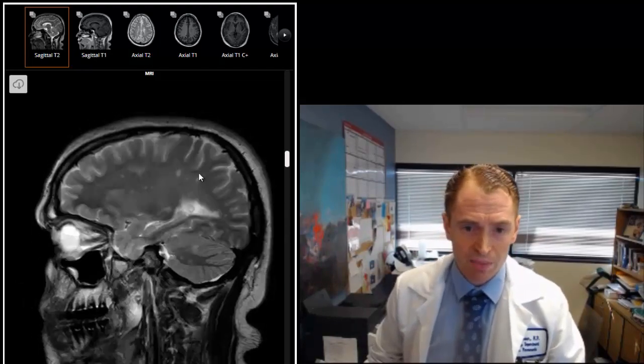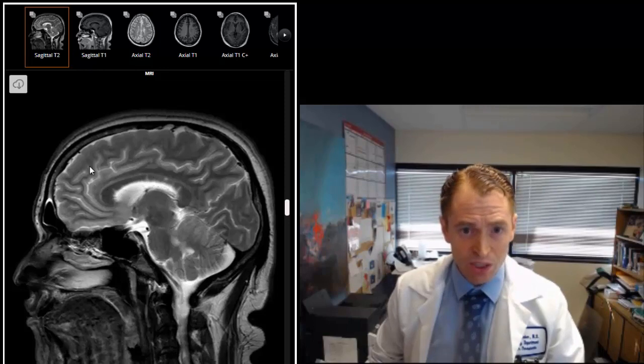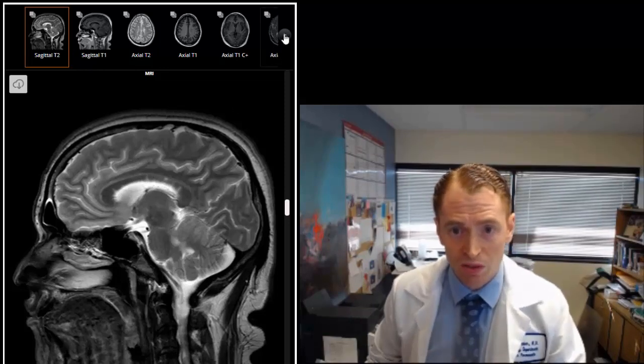You can see some of these other subcortical white matter lesions. When the lesions are sort of lined up like this they call it a white picket fence sign which is a classic sign of multiple sclerosis.